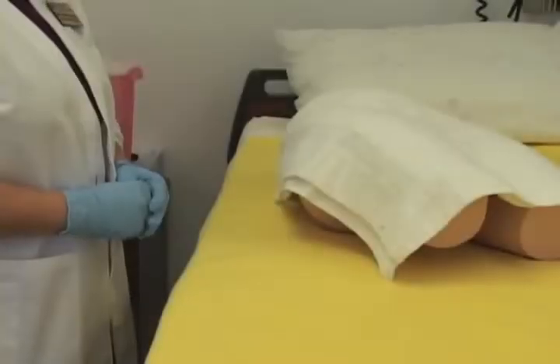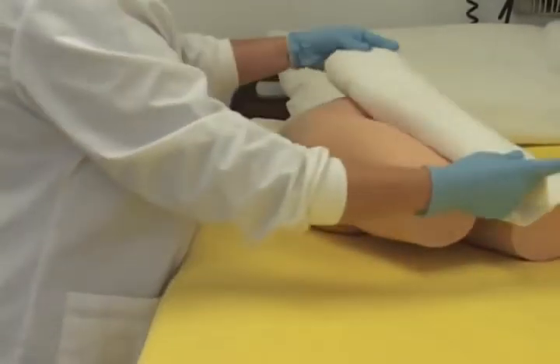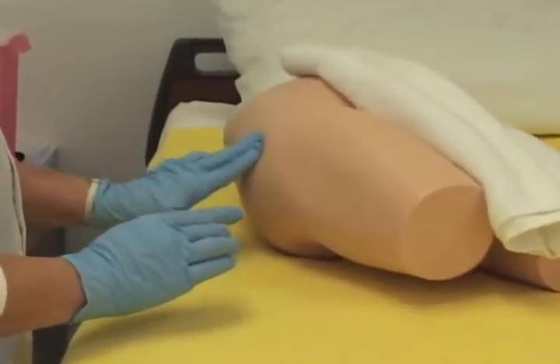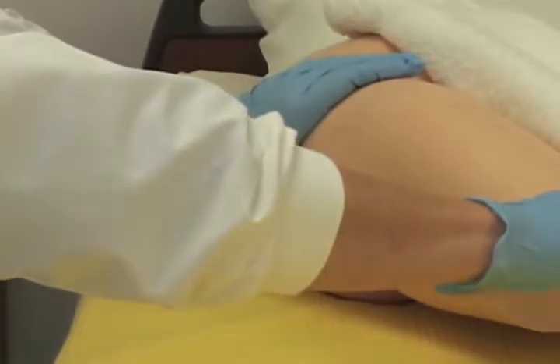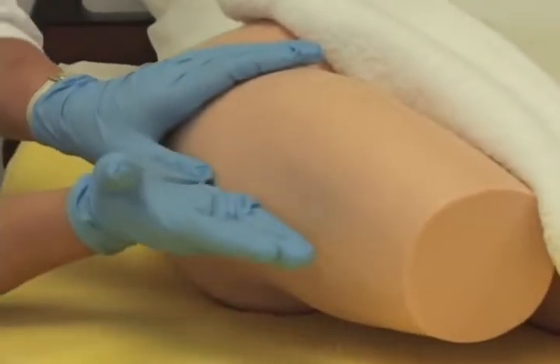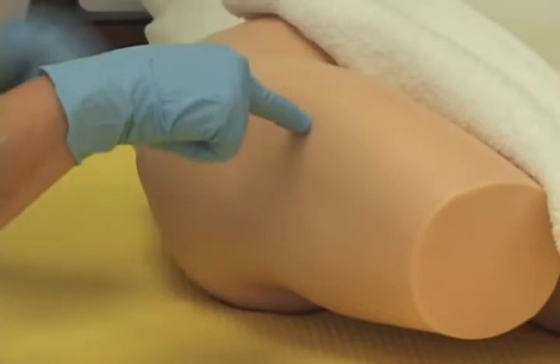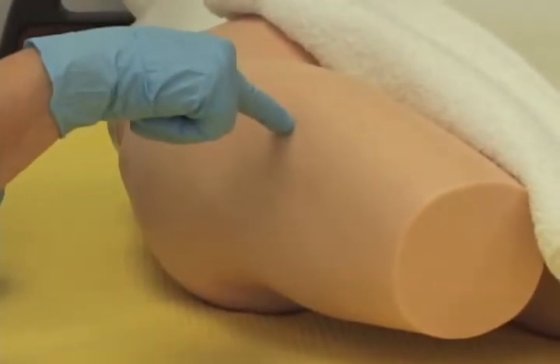You'll demonstrate the vastus lateralis. For this, you need to locate the greater trochanter and put your palm on the greater trochanter and the patella. Put your other hand on the patella. You want the anterior lateral aspect of the thigh. So you don't want the side, you don't want the top of the thigh, you want in between, the anterior lateral aspect. So your injection site will be right here at this angle.